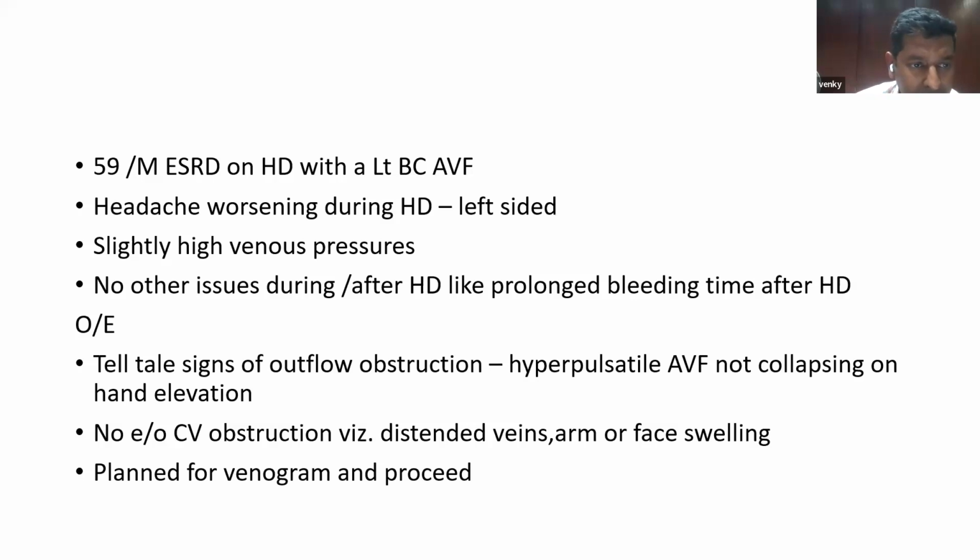On examination, there were telltale signs of outflow obstruction, like an angry-looking hyperpulsatile fistula, which did not collapse on hand elevation. And otherwise, no evidence of central vein obstruction, like distended veins, arm or face swelling, etc. We planned for a venogram and to proceed. And this is the venogram.